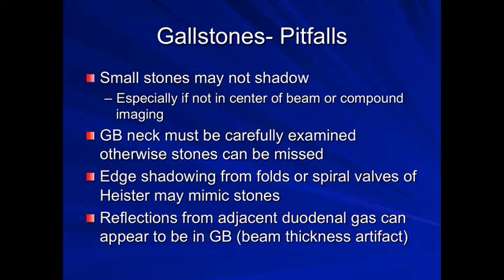So it's always important when scanning for stones to try and line up right over the top of the stone so as to give yourself the best opportunity to detect any shadowing. Some of the machine settings, such as compound imaging, and this is now standard on most ultrasound machines, will also reduce the amount of shadowing that you'll see. And in these cases, if you're uncertain, sometimes it may be worth turning off the compound imaging to determine if there truly is shadowing there.